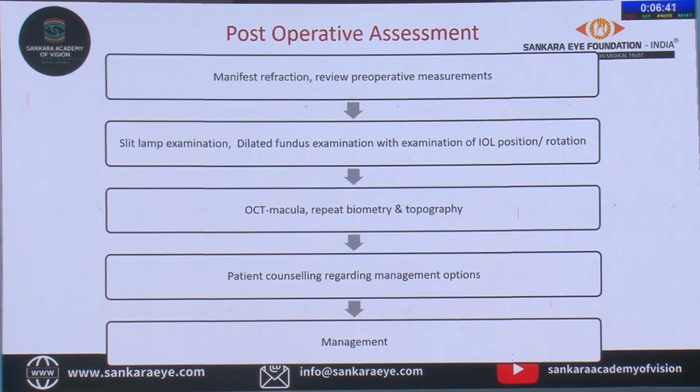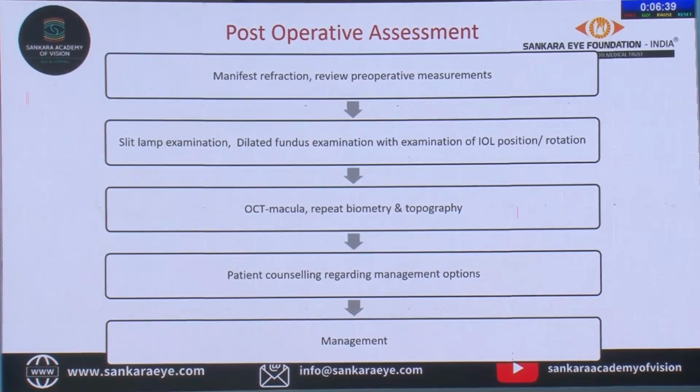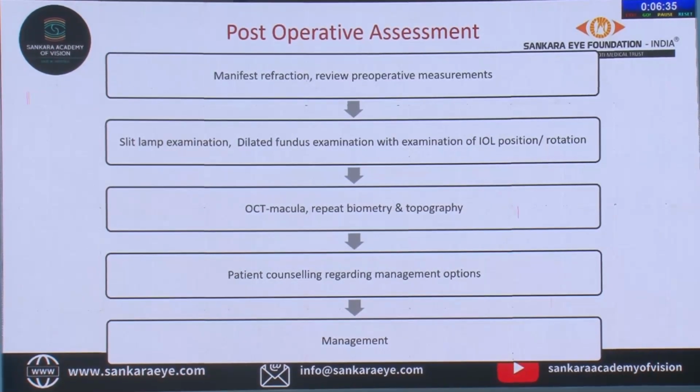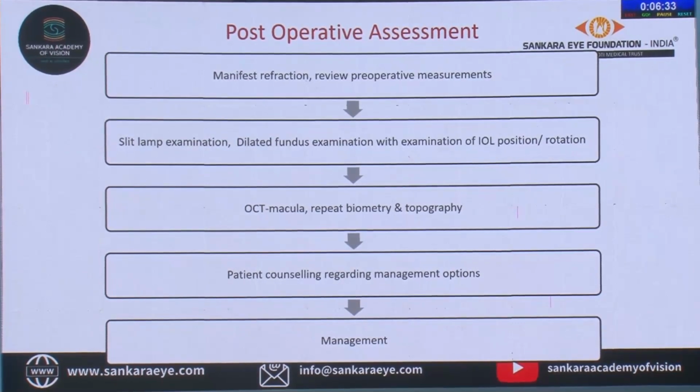Of course, slit lamp examination and dilated fundus exam with respect to the IOL, make sure there is no tilt or decentration, rotation. Mostly what we are seeing is it could be one in the bag, one in the sulcus. So that will induce some astigmatism.